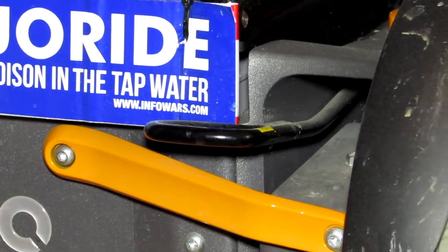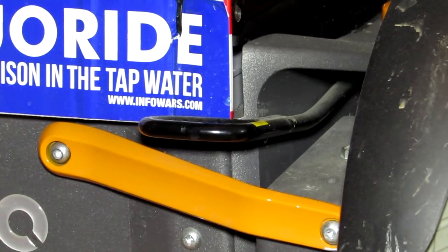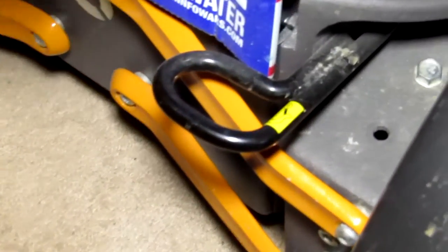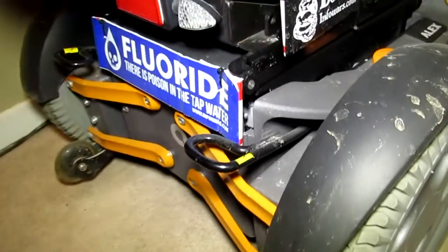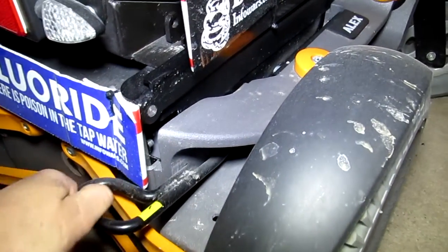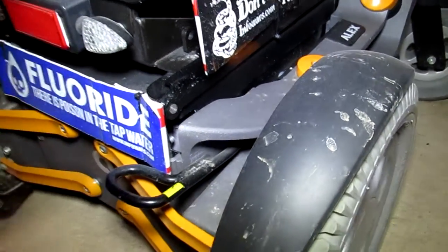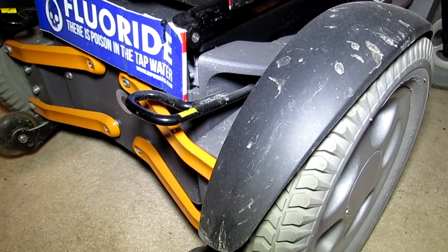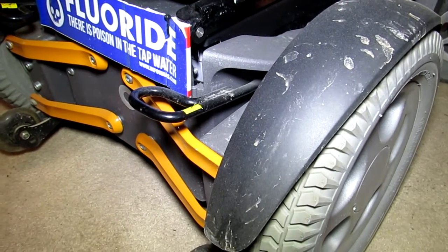This tie-down needs to be made of really solid, rigid, forged steel that doesn't move — but right now this loop tie-down just bounces up and down. It moves up and down really, really easily. When you consider that the chair is around 400 to 500 pounds and then my weight, altogether it's about 800 pounds.